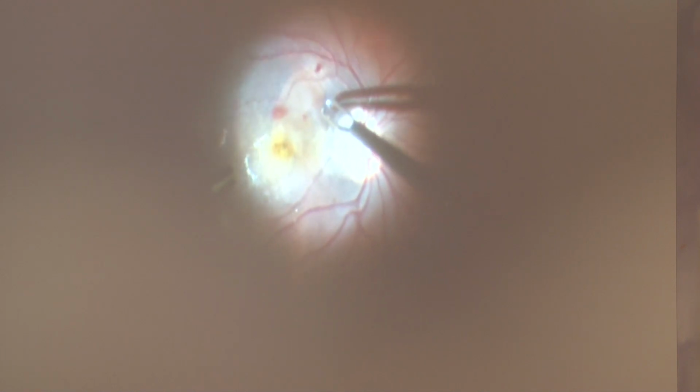We did a 23-gauge pars plana vitrectomy along with ILM peeling. Approximately 3 disc diameters of ILM was peeled, keeping the temporal disc attachment of the ILM flap intact.